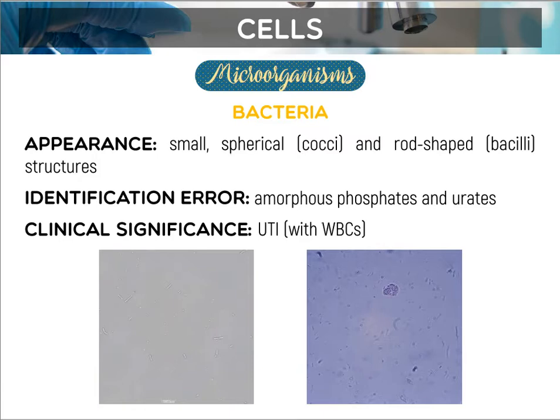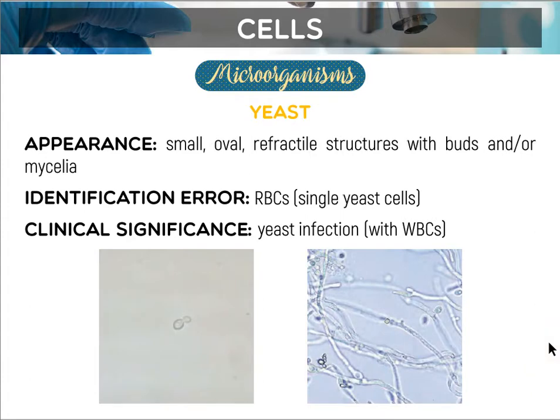Okay, and then these bacteria are reported using rare, few, moderate, many per HPF. Okay, so just a quick side note: the bacteria most frequently associated with UTI are your gram-negative rods, also known as your Enterobacteriaceae. But it is not limited to your Enterobacteriaceae. We also have cocci, di ba? We have your Staphylococcus and your Enterococcus, okay? They are also capable of UTI, okay?